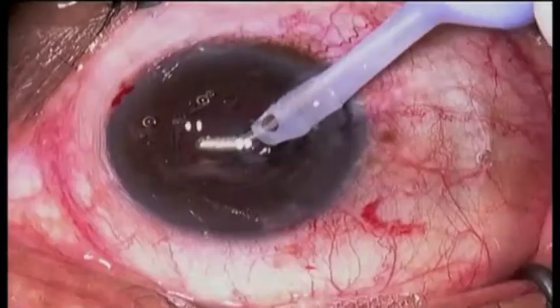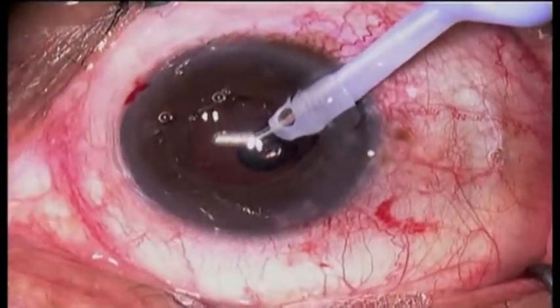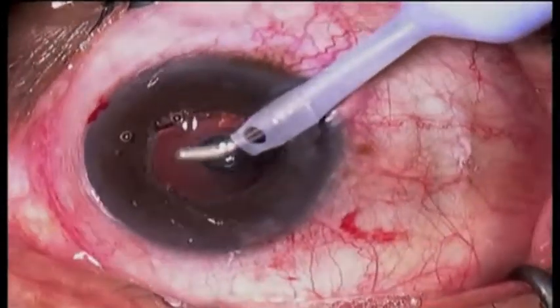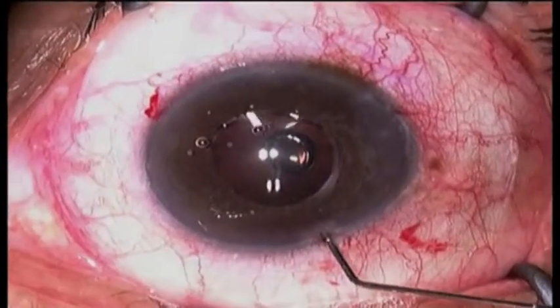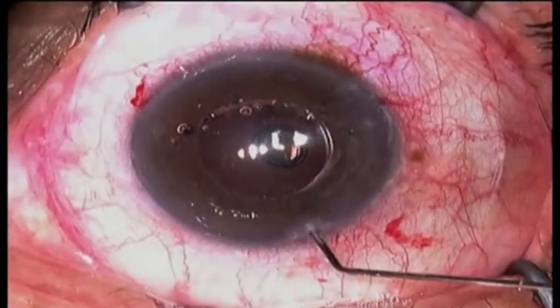The residual viscoelastic is removed, and the anterior chamber is filled with BSS to secure the wounds, and the procedure is completed.